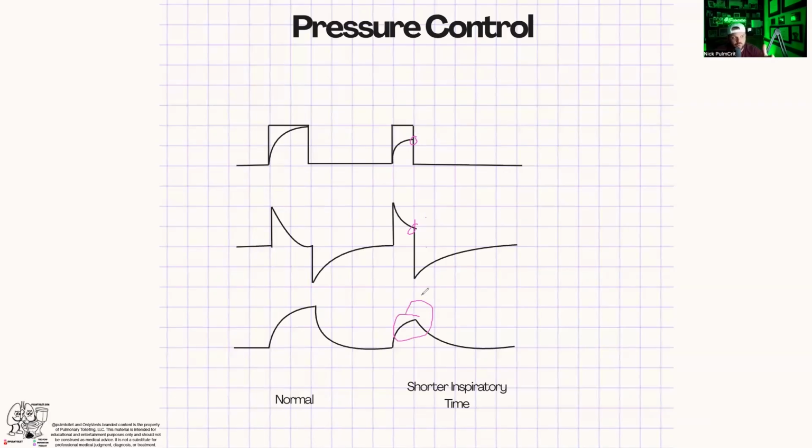Now, obviously that's important because if the pH was some number and you cut the inspiratory time in half, then the minute ventilation is going to go down, the pH will go down because your PCO2 will rise, etc. So, shorter inspiratory time is easier to comprehend. Longer inspiratory time is why I think it's important to think about it from the point of the equation of motion, because when you think about it in setting up pressure differentials, you're able to deduce what you're seeing on the waveforms better.